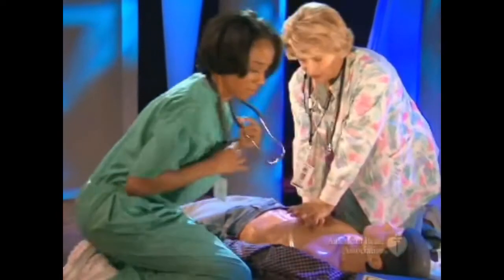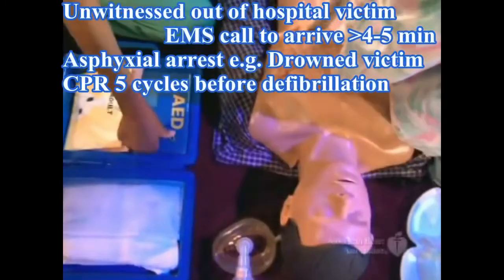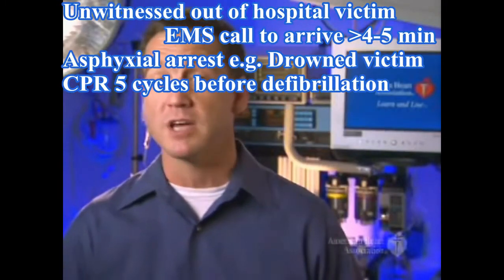When the AED arrives, put it near the rescuer who will be operating the AED and turn it on. Some AEDs turn on when you lift the cover. Others have a power button.